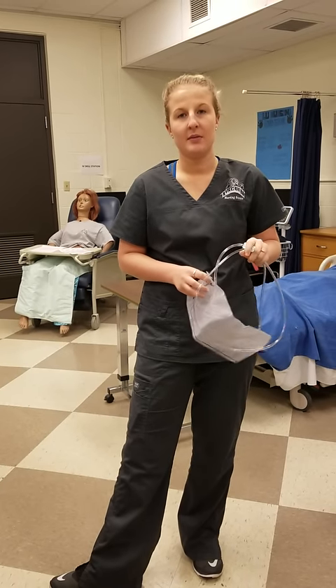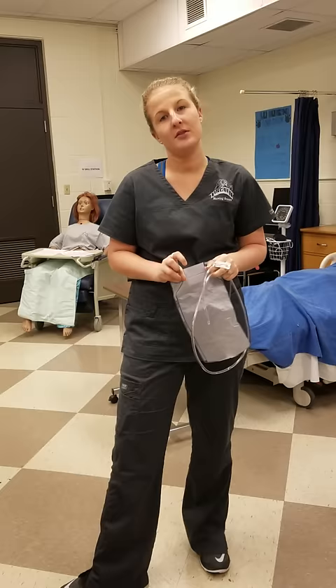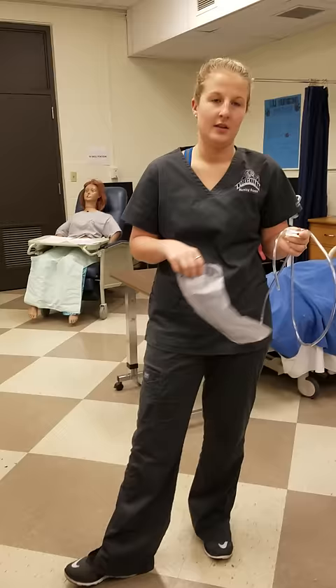Hi, my name is Mackenzie Darius. I'm a first semester nursing student. It is November 3rd, 2016 at 12 o'clock in the afternoon and I'm going to demonstrate how to insert an enema and remove it.